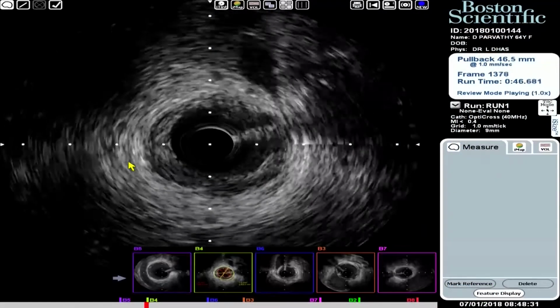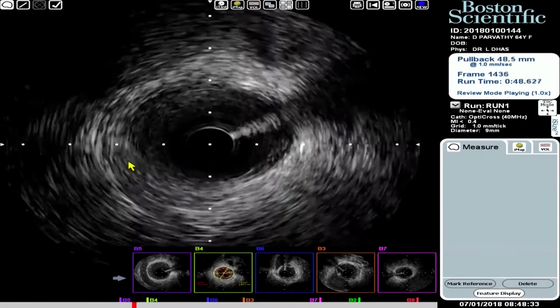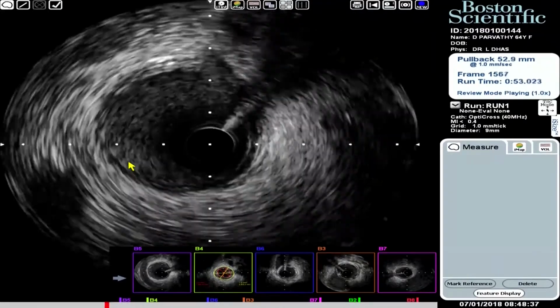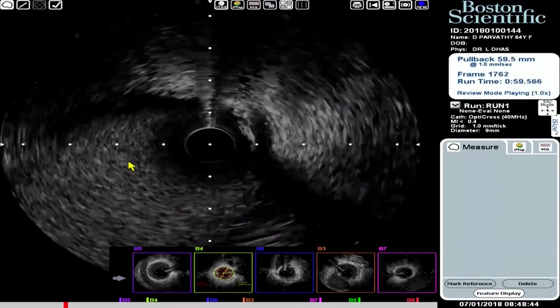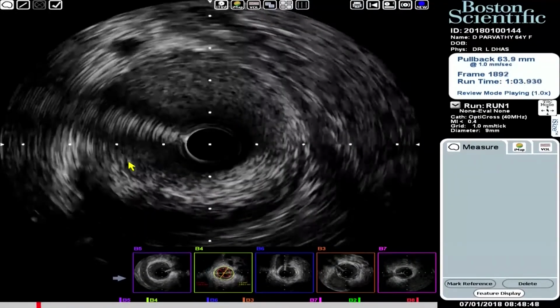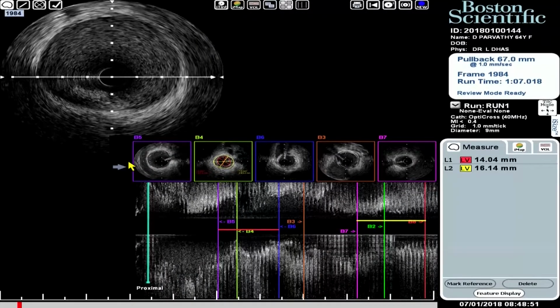Yeah, just here you can see a lot of plaque. We are approaching the proximal lesion, and hardly any calcium again. And distally, we had good landing zones. So this is two type A lesions. Distal one is 2.5 millimeter and proximal one is 2.75 millimeter. We measured the length and distal one was 15 millimeter and the proximal one was again 15 millimeters. So we chose the 2.25 millimeter stent distally, 2.5 and 18.